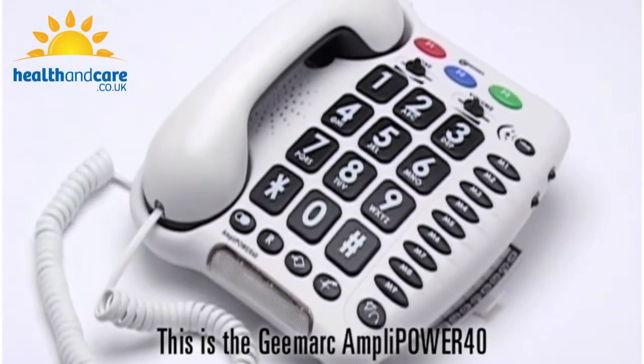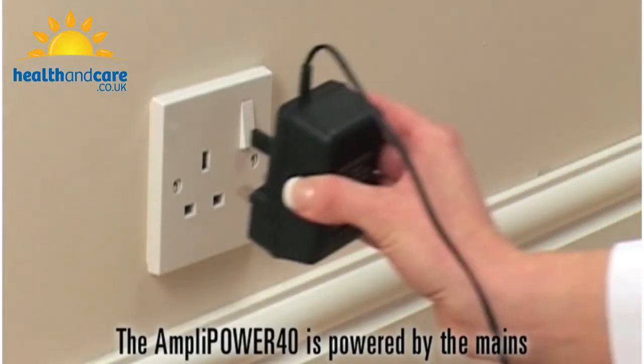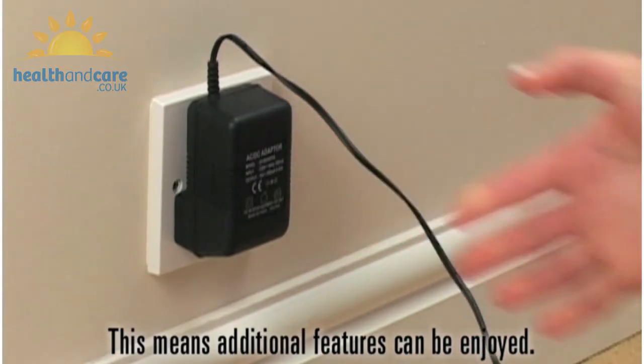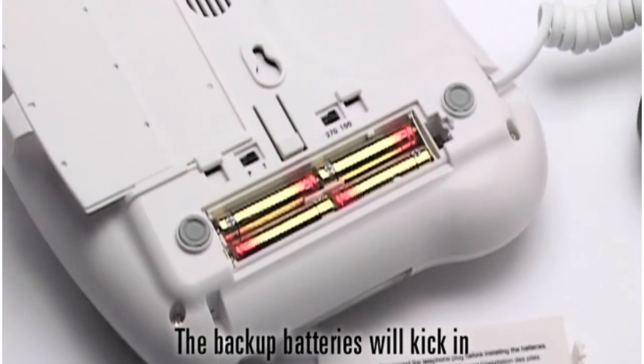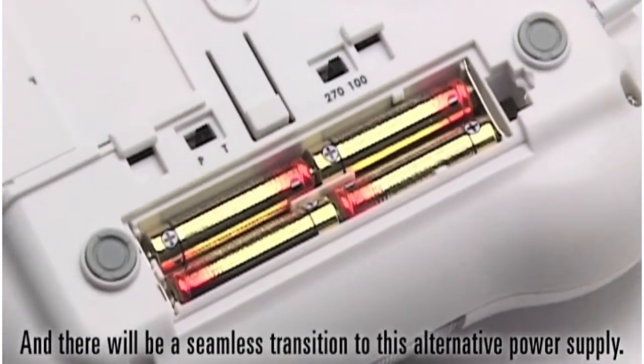This is the G-Mark AmpliPower 40, an amplified telephone with volume and tone control. The AmpliPower 40 is powered by the mains, which means additional features can be enjoyed. However, in case of a power failure, the backup batteries will kick in and there will be a seamless transition to this alternative power supply.